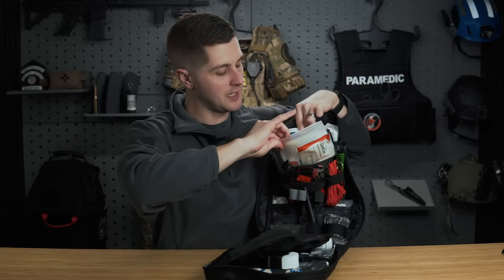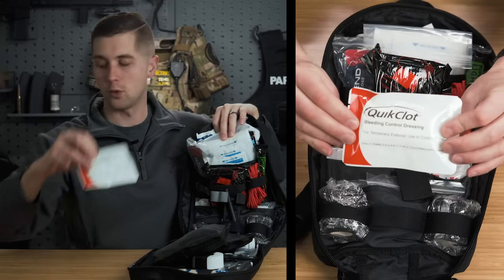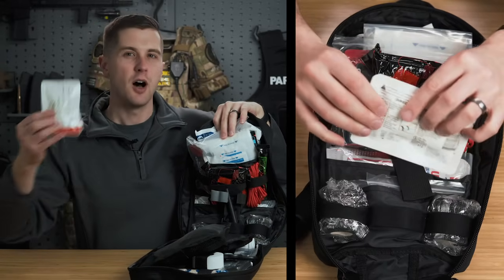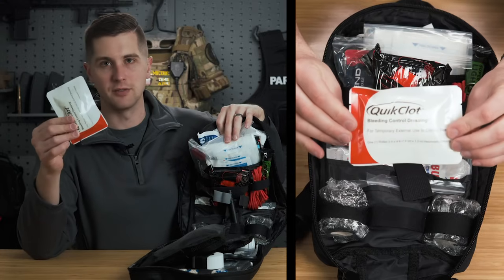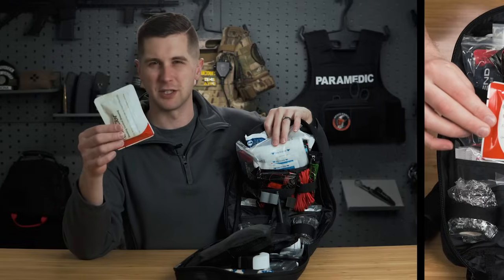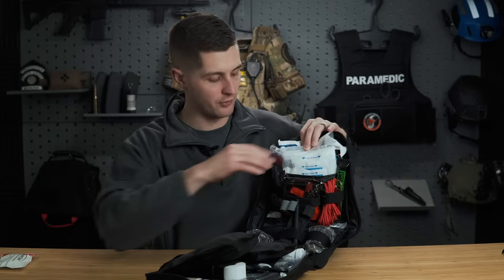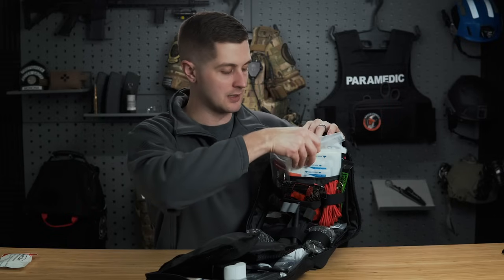Okay, so coming into the pocket right next to that, we've got QuikClot for wound packing, which is a great thing to have. I'll probably replace this with the LE version. It's vacuum packed, you get a little bit more in the roll. That's what I prefer using for wound packing, but this will work great for you in most cases.